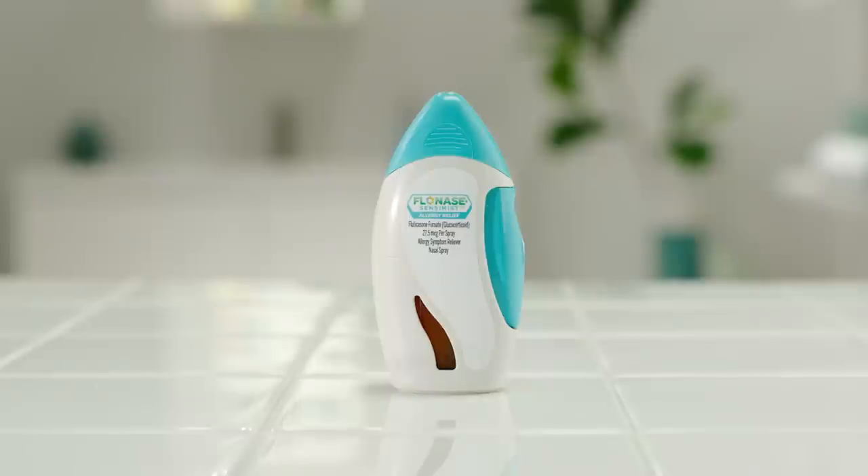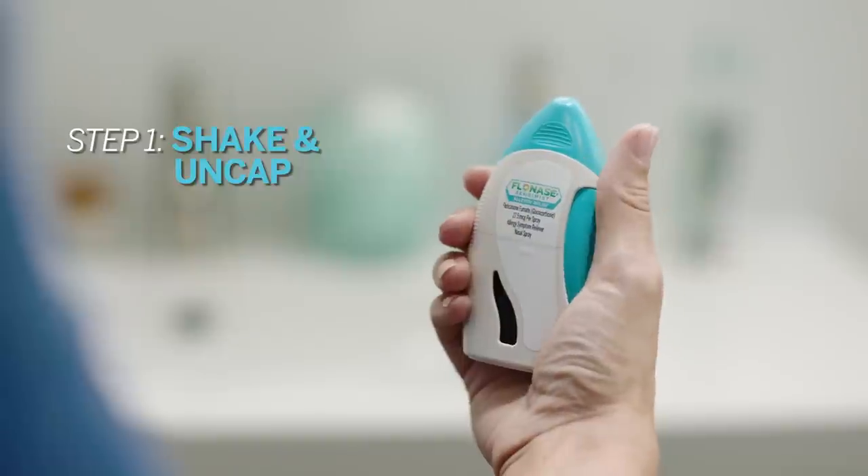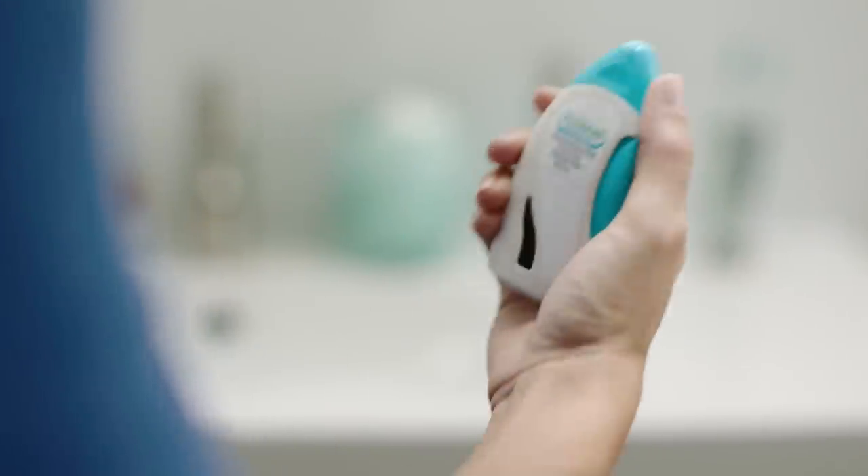In order for Flonase Sensimist to work the way it was meant to, it's important you get a full dose every time. Let's find out how. Before each use, shake your bottle of Flonase Sensimist vigorously and with your thumb and forefinger, gently squeeze the sides of the cap and pull it straight off.